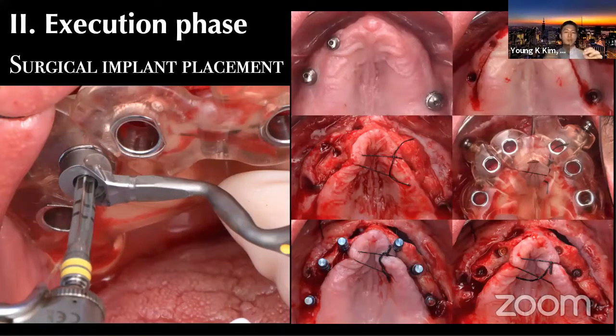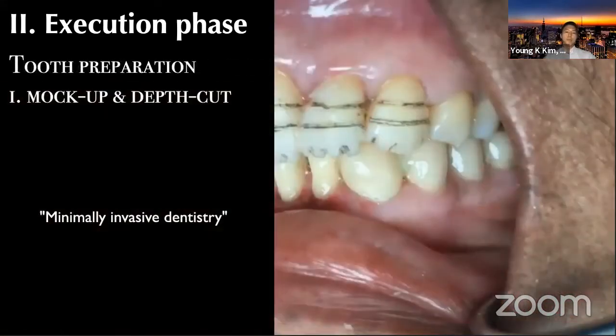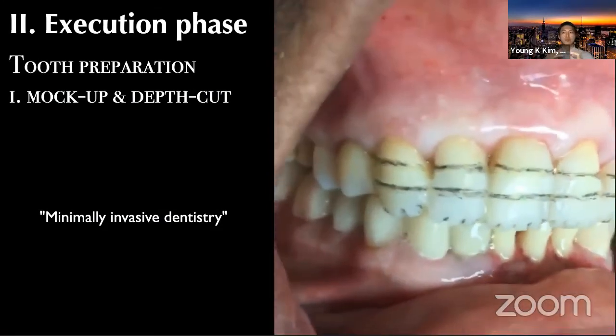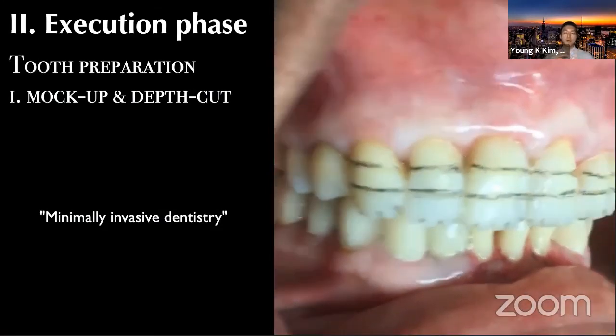And you can then do the surgical, you can phase your surgical placements, or you can just place everything all together, and it's really up to you as a reconstructive dentist. You plan out your plan, and then as the execution phase, you move on to the tooth prep. I personally prefer to use the mock-up, just like you're doing for the veneer prep, so that you can keep minimally invasive dentistry.